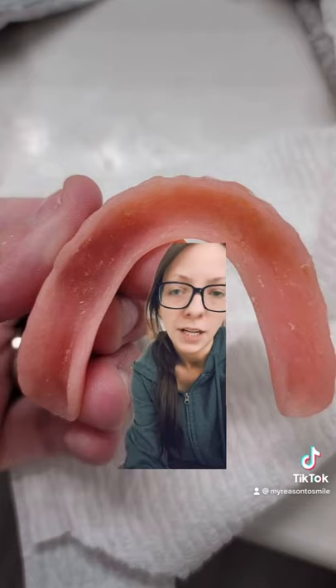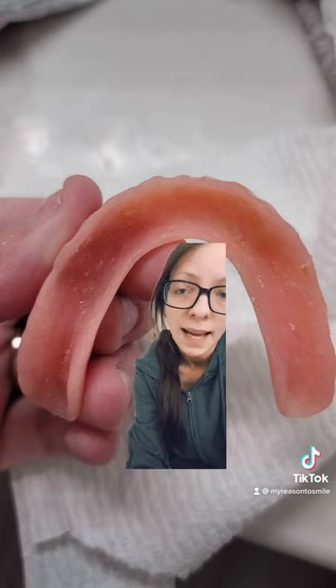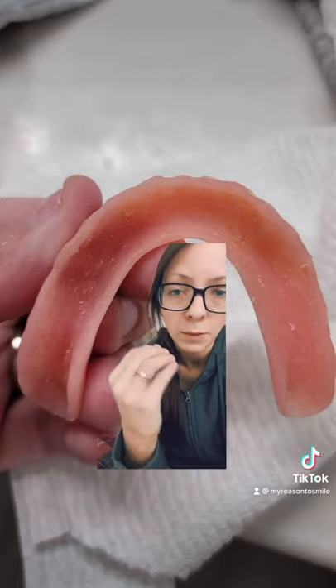So this is my lower denture without anything in it. There's no soft re-line, there's no cushion grip. As you can see it looks kind of wide where my gums would go.